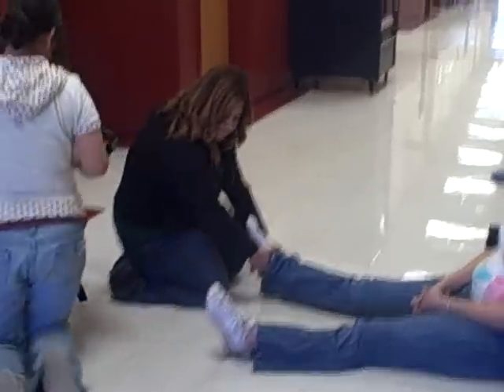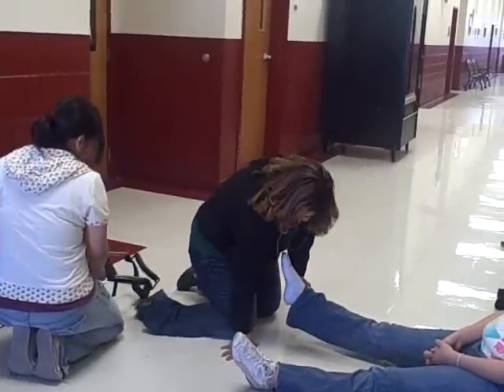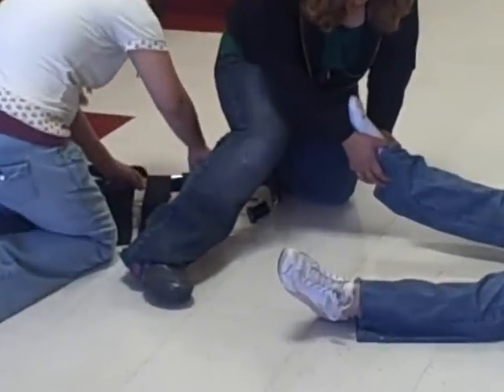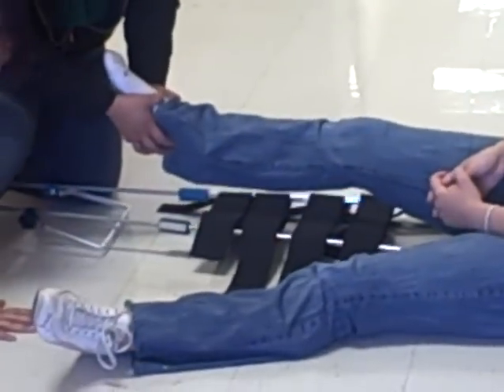Now I'll come over here behind my patient and then I will put it underneath.